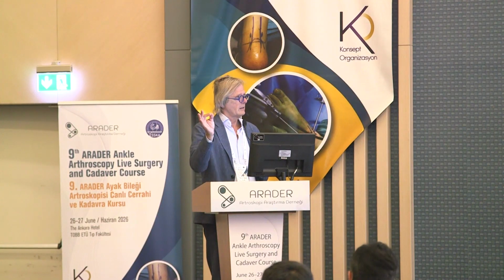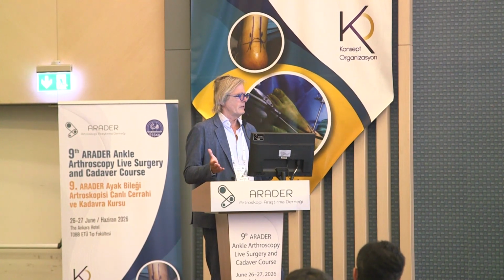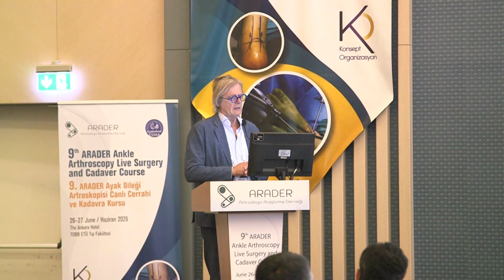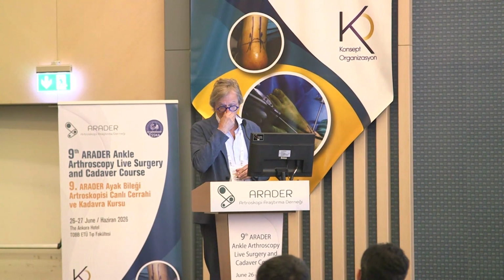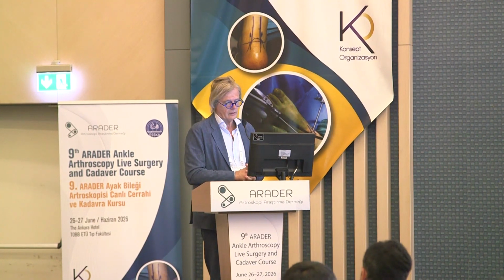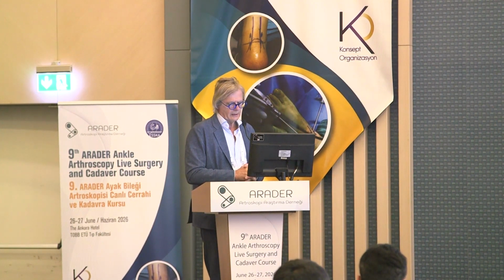So that's another item. If they have limited dorsiflexion, of course you have to take away also the osteophytes because they limit the dorsiflexion. So if that's their question, not only the pain but also the limitation of dorsiflexion, then of course you are not going to start with PRP. You will just straight away go with doing it.